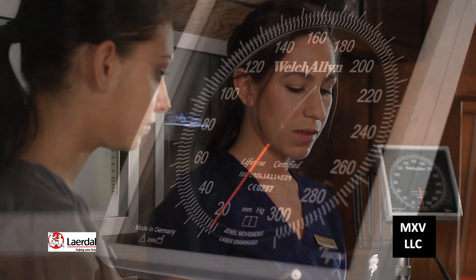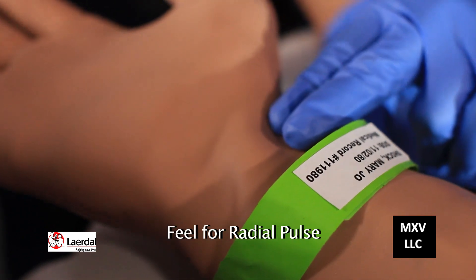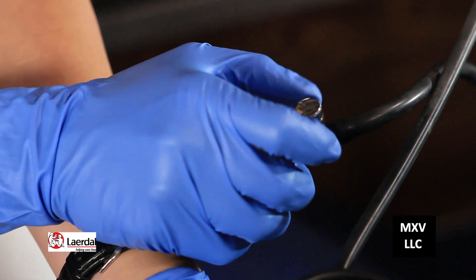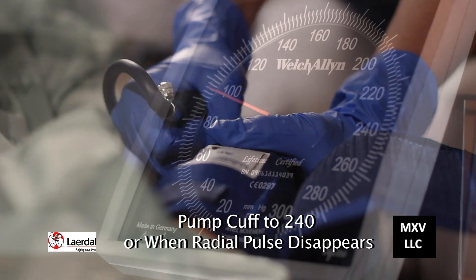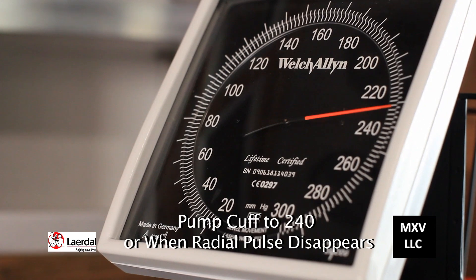Put the earbuds of the stethoscope in — we cleaned them with alcohol already. Put your two fingers over the radial artery and feel for the radial pulse. Take the bulb and turn the valve all the way to the right until it's tight. Pump it up to about 240, listening for the radial pulse to disappear, then pump it up a little bit more.